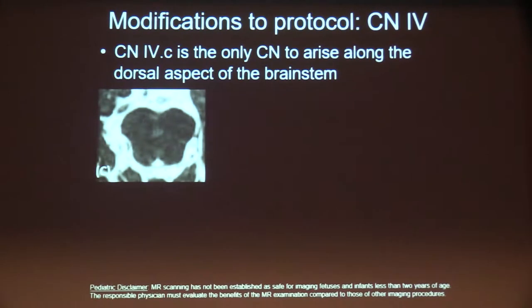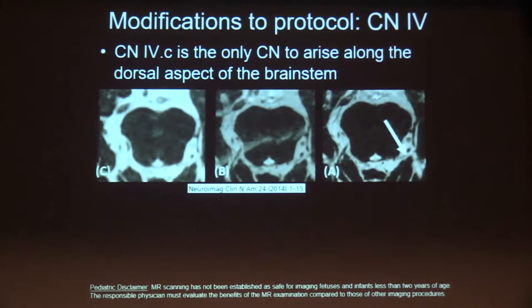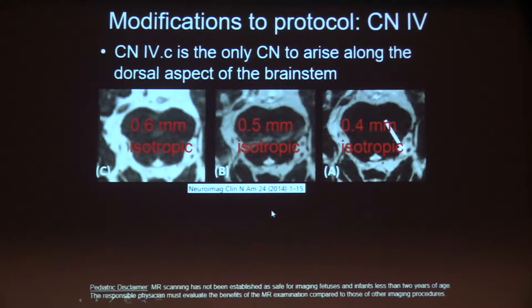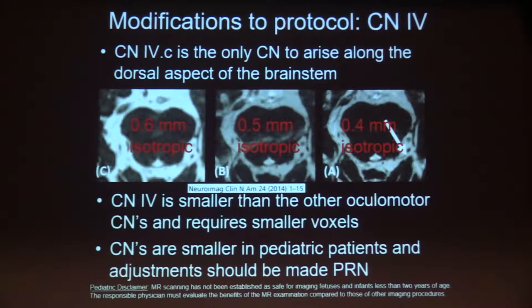Sometimes we do modify the protocol. The fourth cranial nerve is one of the smallest in diameter. In this patient imaged for trochlear nerve palsy, at 0.6 mm isotropic CISS imaging without contrast I wasn't able to see the nerve well — in fact, often what we think we see on standard imaging can be adjacent veins in this region. It was only at 0.4 mm isotropic that you can begin to see with confidence the trochlear nerve extending through the cistern.